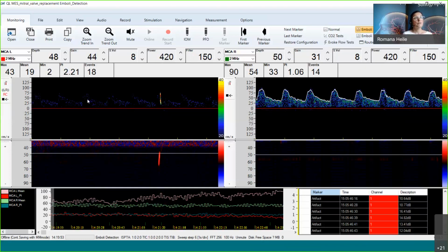So as a general rule, when you set up the MCA Doppler spectra, also adjust the gain in a way that the Doppler spectra is more dark, so reduce gain. Dependent on whether you also need correctly calculated indices, you have to make a compromise. Reduce gain, but in a way that the envelope is still set correctly.